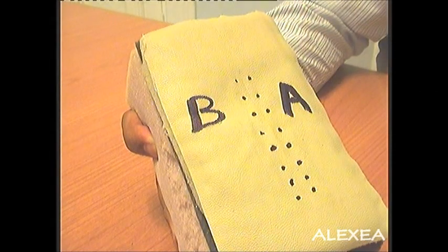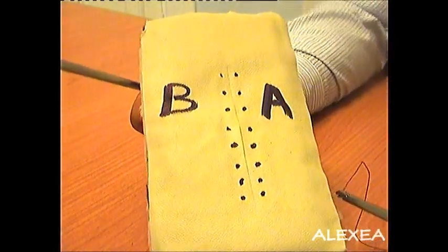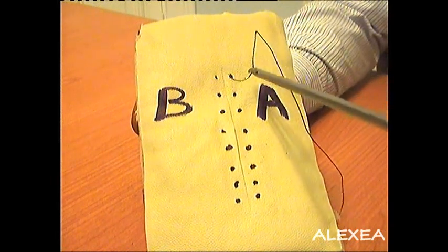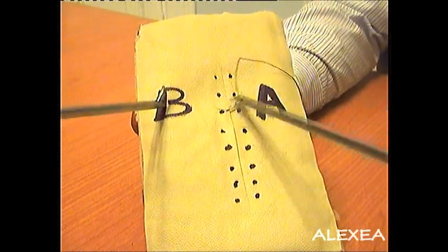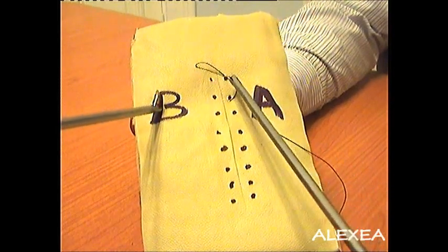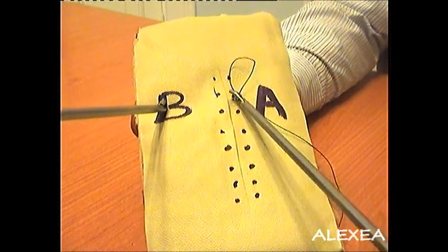We are going to attempt to simplify laparoscopic suturing. The intention is to hold the needle in the right hand with the needle holder on side A. Take the needle and take it vertically down and initiate the stitch. Come out on side B.